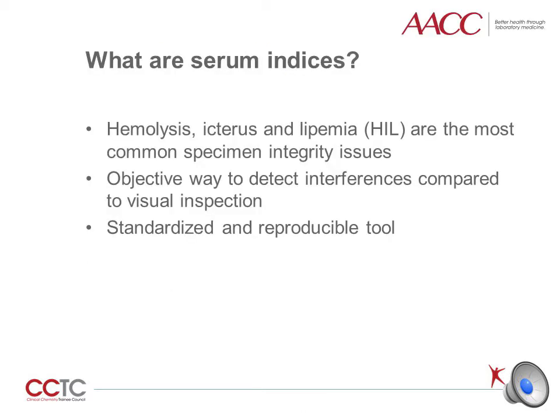Hemolysis, Icterus, and Lipemia, also commonly known as HIL, are the most common specimen integrity issues that can interfere with laboratory tests and may lead to erroneous results and interpretations, and ultimately to inappropriate medical decisions. HIL indices are an objective way to detect interferences compared to the traditional practice of visual inspection. Visual inspection is subjective, unreliable, and time-consuming, whereas measurements of serum indices are available on most modern-day chemistry analyzers and provide a standardized and reproducible tool to estimate interferences.